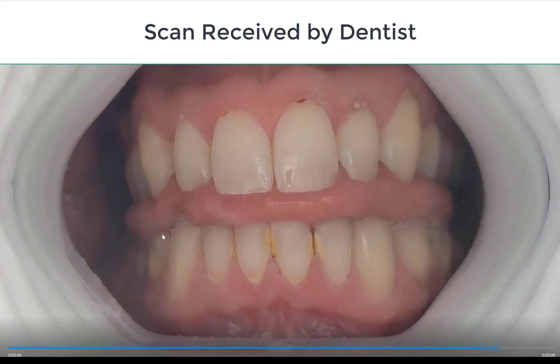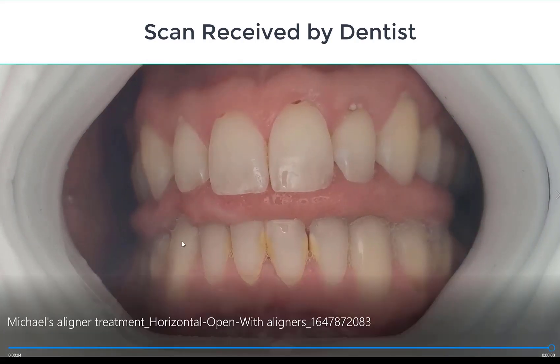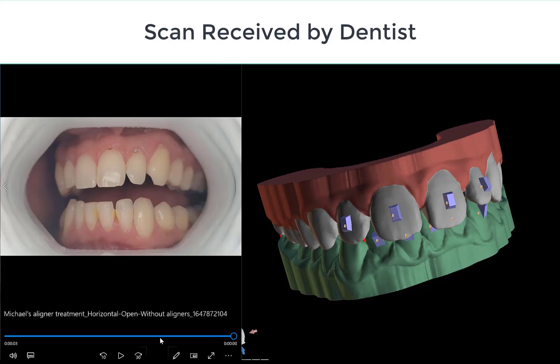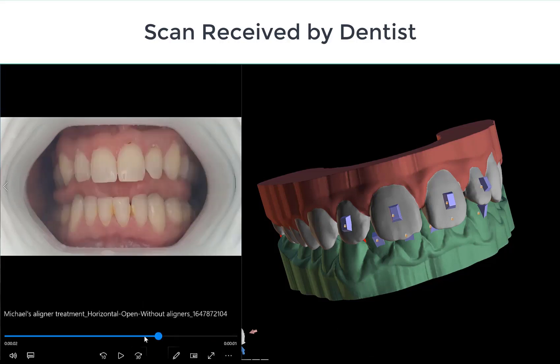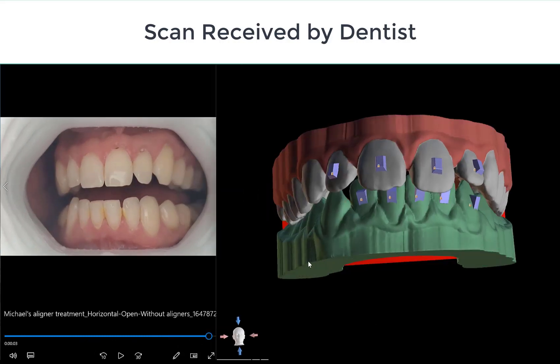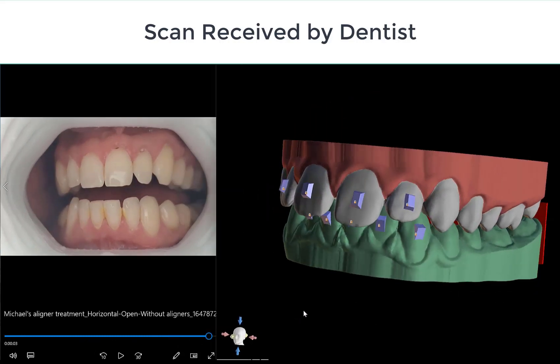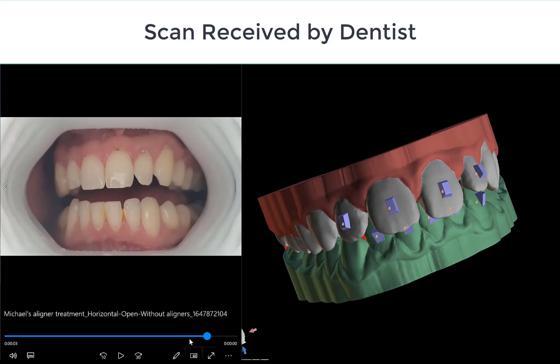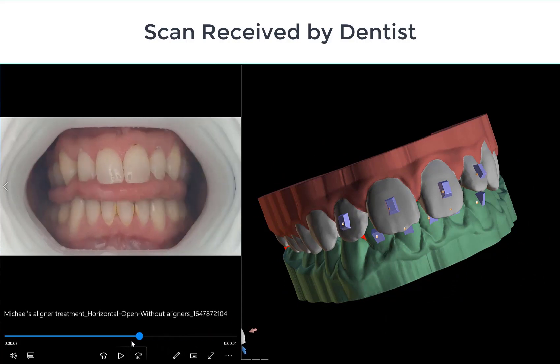We could see the details of the teeth. And as an additional option, the dentist could open the treatment plan and compare the models — the planned models at the relevant step — to the scans they received from the patient.